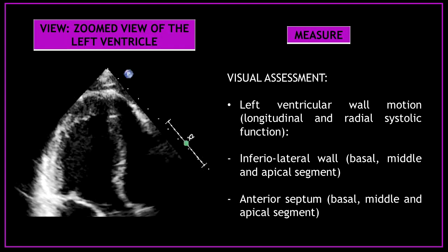Obtain a zoom view of the left ventricle and perform a visual assessment of the left ventricular wall motion. Analyze the longitudinal and radial systolic function of the inferolateral wall and the anterior septum.